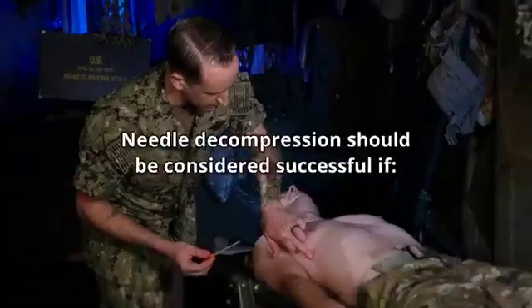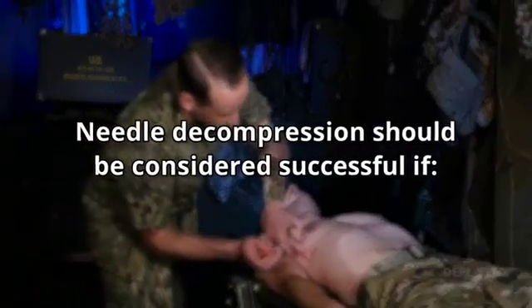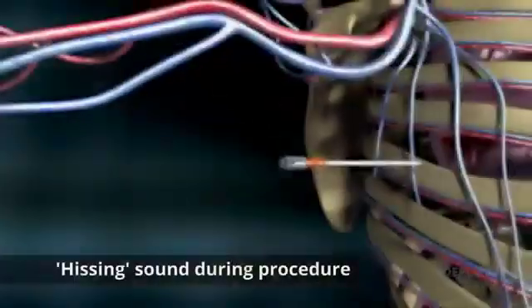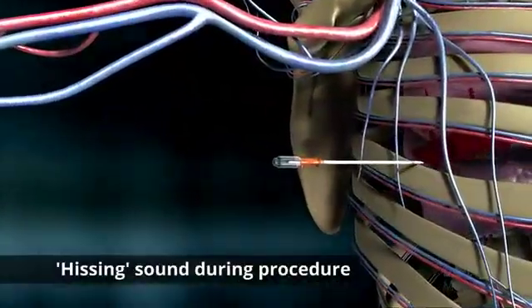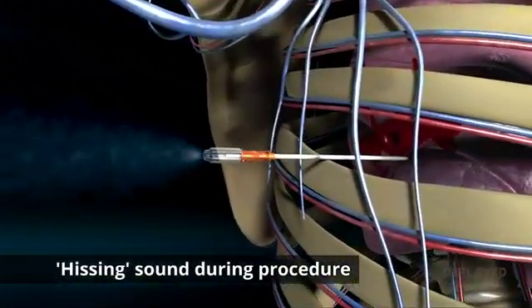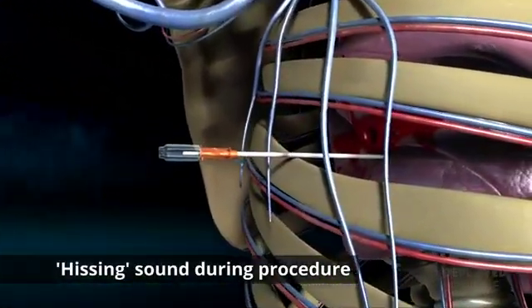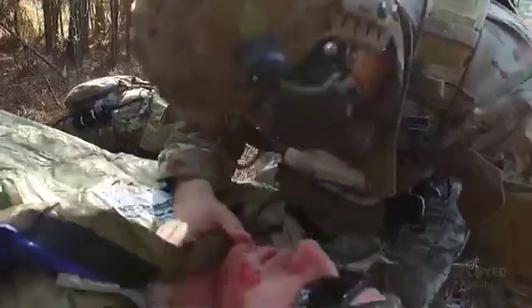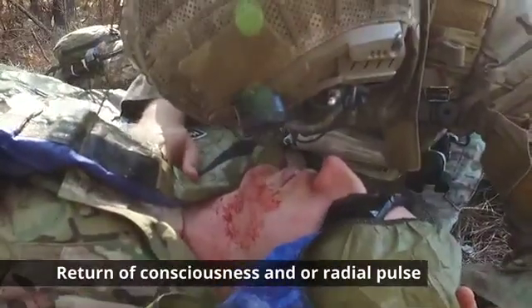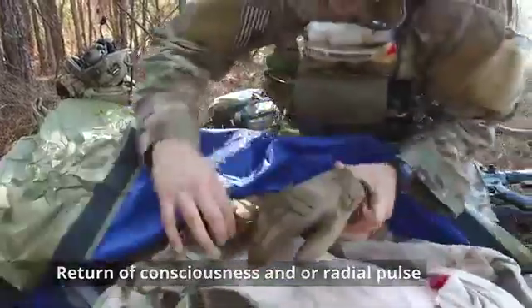The NDC should be considered successful if respiratory distress improves, or there is an obvious hissing sound as air escapes from the chest when the NDC is performed. This may be difficult to appreciate in high noise environments, or if a casualty with no vital signs has returned to consciousness and/or radial pulse.